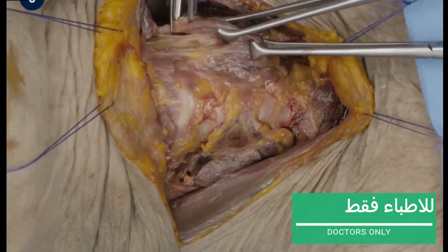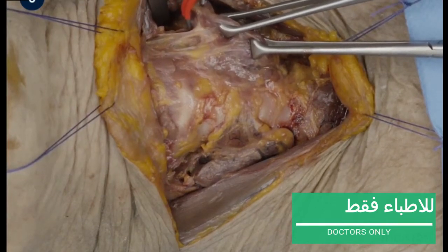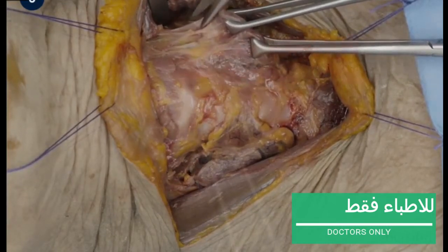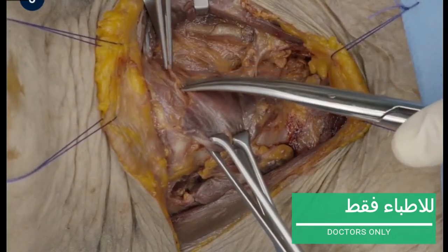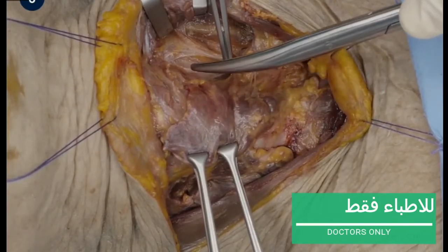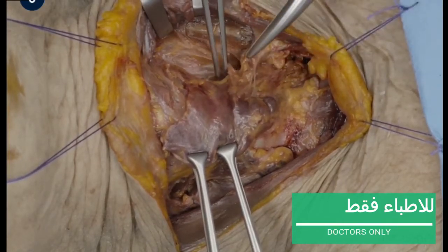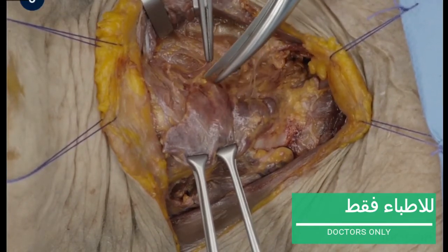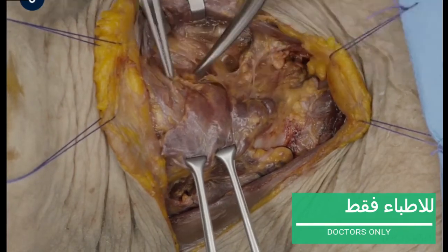Then the upper pole is mobilized. Here the superior thyroid artery is ligated. The superior parathyroid gland is identified as this moving structure. This is the dissection plane that should be followed to preserve the arterial supply of the parathyroid gland. Now this parathyroid gland is even more visible.